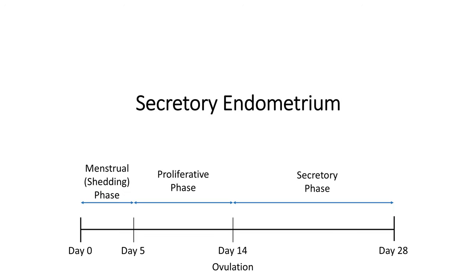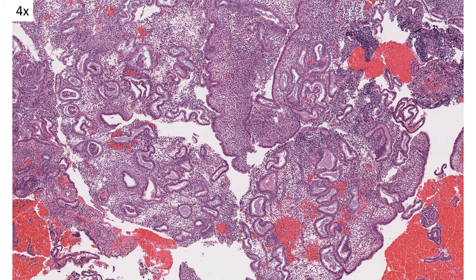Let's move on to secretory endometrium — what we see in the luteal phase after ovulation until the start of menses. At low power on this biopsy, in contrast to the proliferative endometrium, the biopsy looks very pink because it's not quite as cellular and has more cytoplasm overall. There is cleared-out space between the glands — this is edema in the stroma, very common especially early in the secretory phase. The gland contour also looks different: instead of those nice round glands, we have irregularly shaped glands that can look a little bunched together. That's an innate feature of secretory endometrium and does not necessarily indicate hyperplasia.